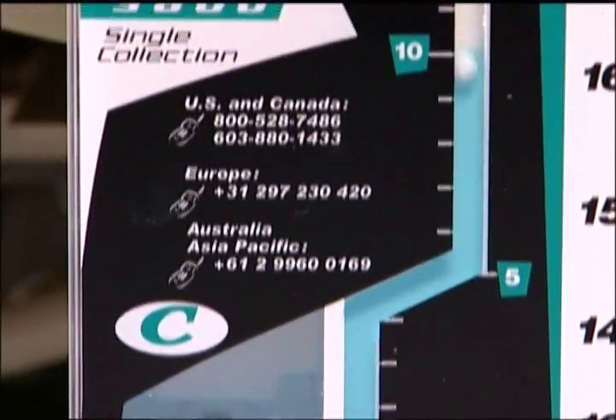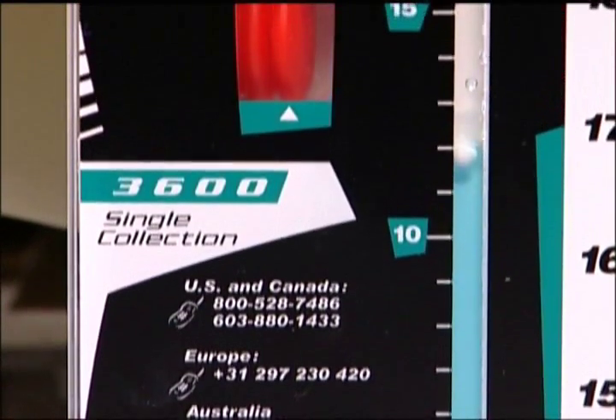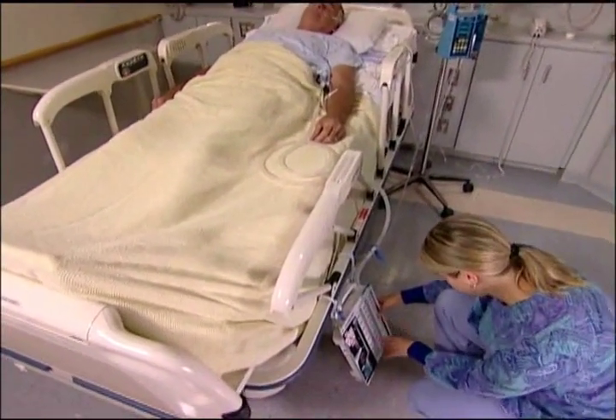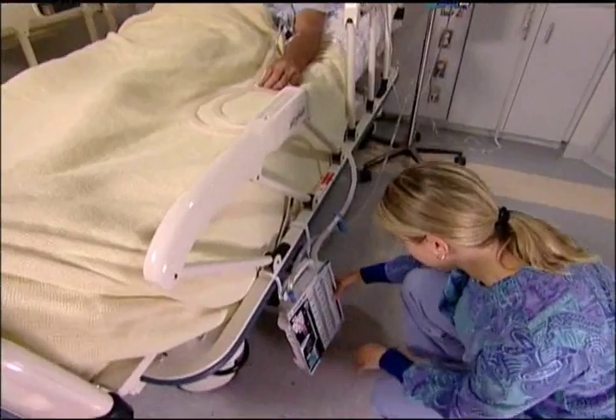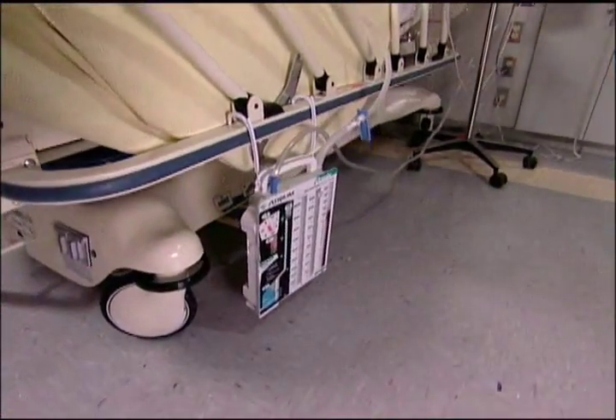Changes in intrathoracic pressure can be determined by observing the level of the blue tint water and float ball in the calibrated water seal column. Atrium's blue tint water and float ball make changes in patient pressure easy to monitor, even in low light conditions or from a distance.